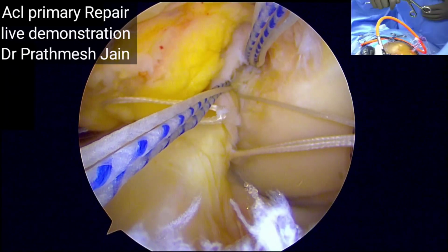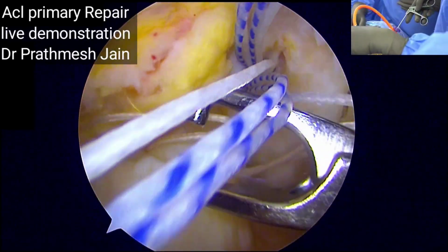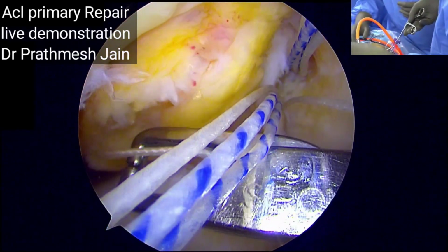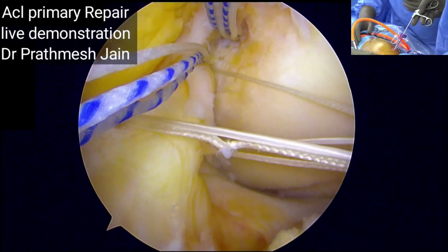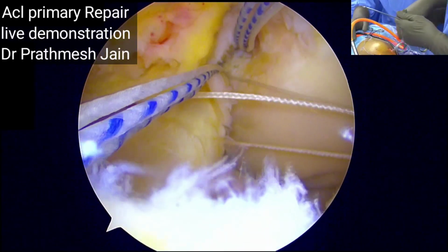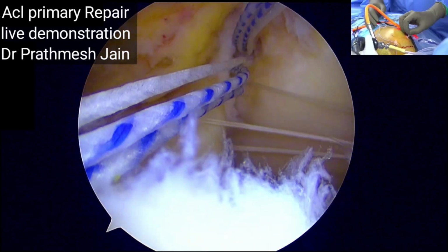Green retriever please. So you can see that we have passed the first suture into its place. So this is the first suture from the inferior. Okay, so we are good here. Give me the grasper. So I'm good.